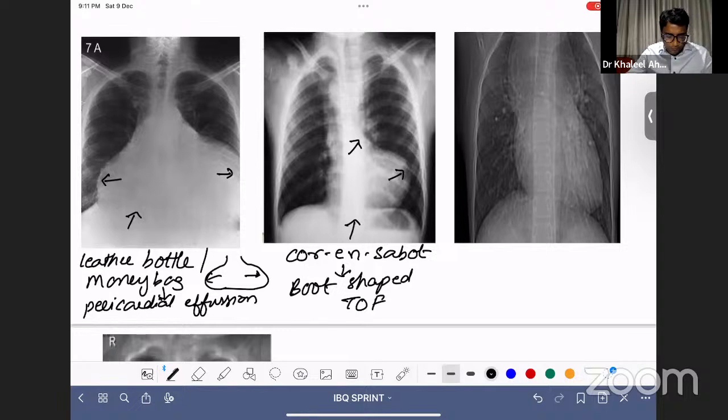What about the third one? What do you think is the third one? Very good. Preeti, Tejasvi, Mithilesh, Rishabh. Good. Sai, Aiza, Kawel. Very good, Shrayesh, Dhaya. Tell me about the third one now.